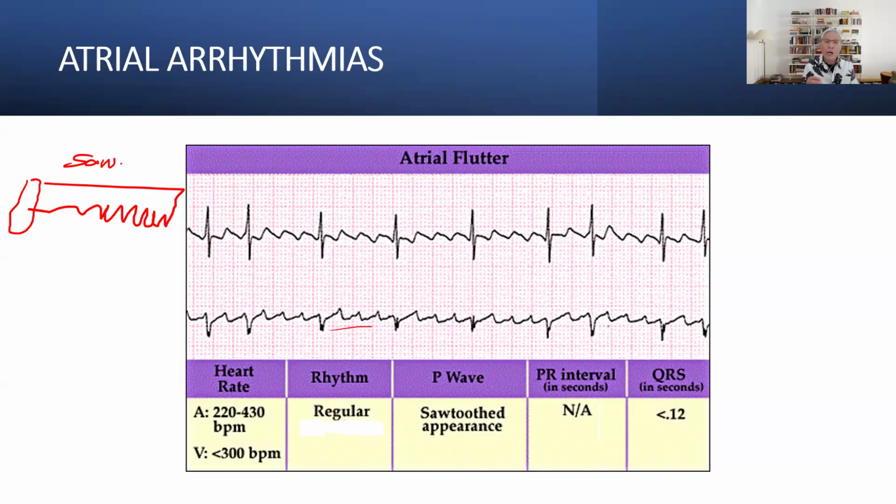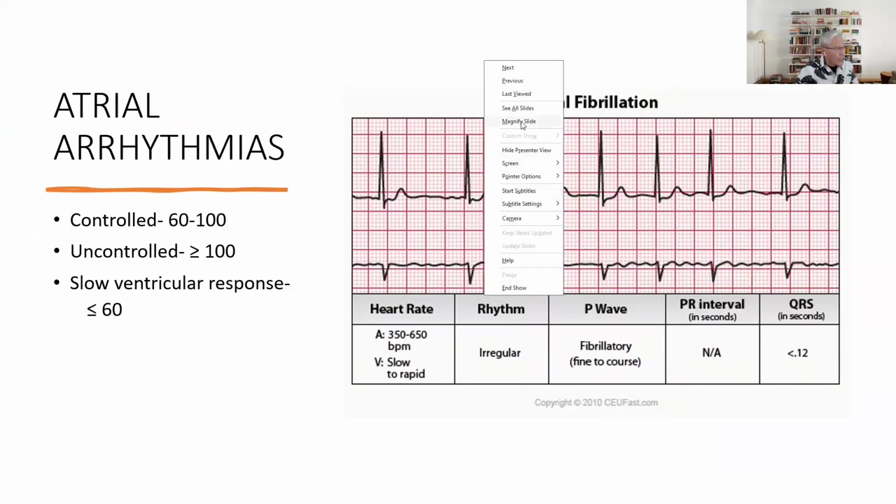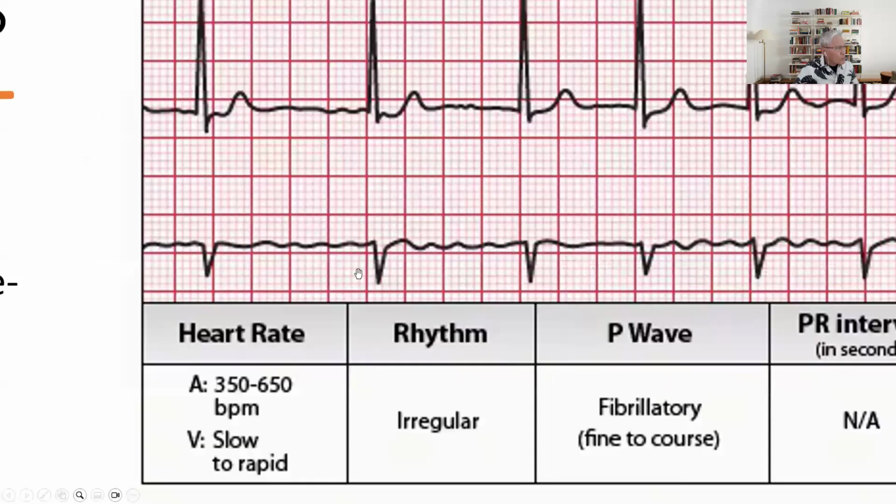And we'll learn more about what the effects are. Now, it is a relative of another rhythm called atrial fibrillation, which is even faster. I said atrial flutter was like this. Atrial fibrillation is like this. Notice again over here the undulations, like small sawtooth right here. Big teeth is atrial flutter, small teeth is atrial fib.